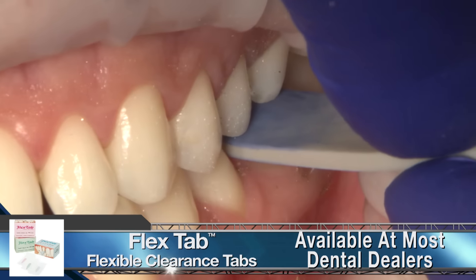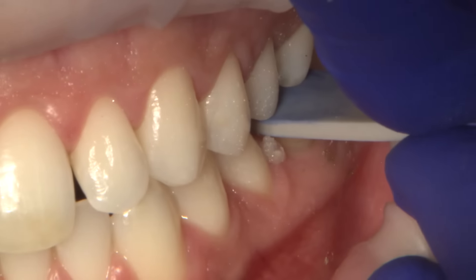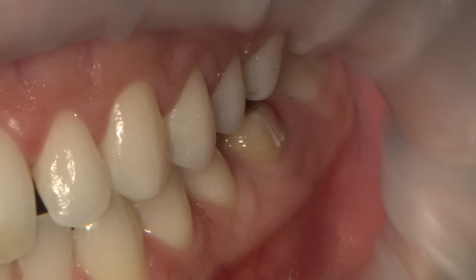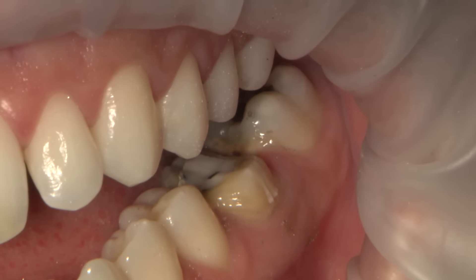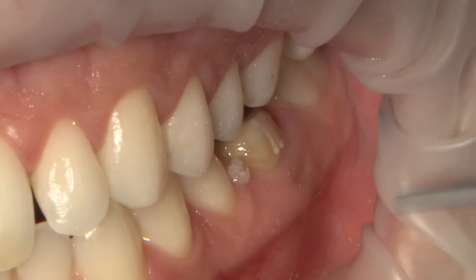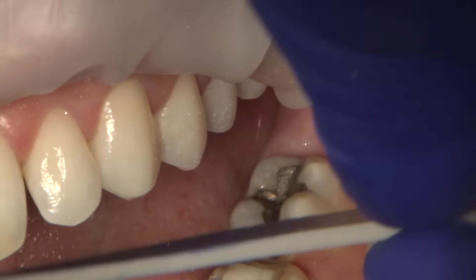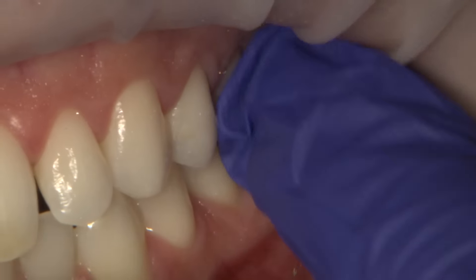To verify we have enough clearance between the prep and opposing, we insert a one and a half millimeter thick clearance tab and have the patient bite down. If the tab pulls freely without much force, adequate clearance has been achieved. Articulating paper dye can be rubbed on the clearance tab to mark where additional reduction may be necessary.